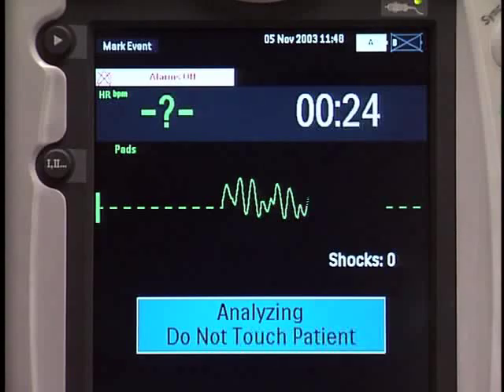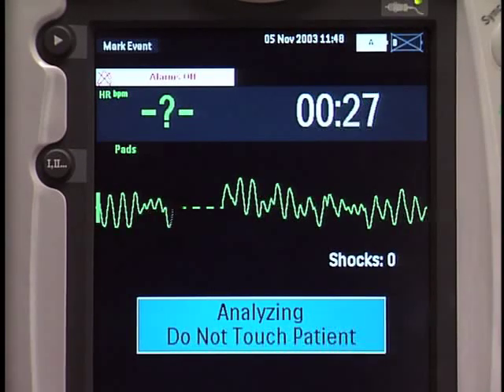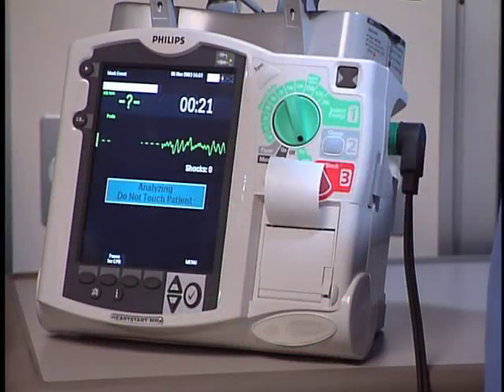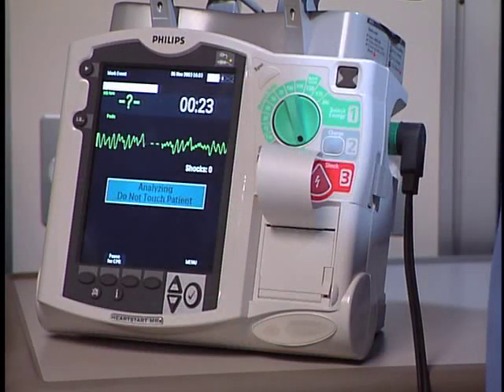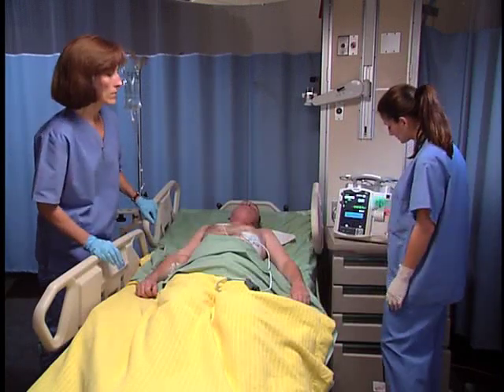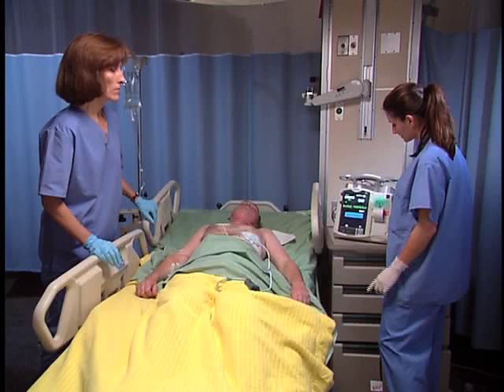Analyzing heart rhythm. Do not touch the patient. The MRX analyzes the heart rhythm and announces if a shock is advised. Shock advised. The MRX automatically charges to 150 joules.